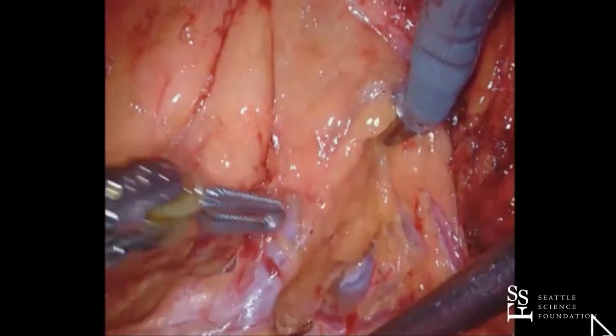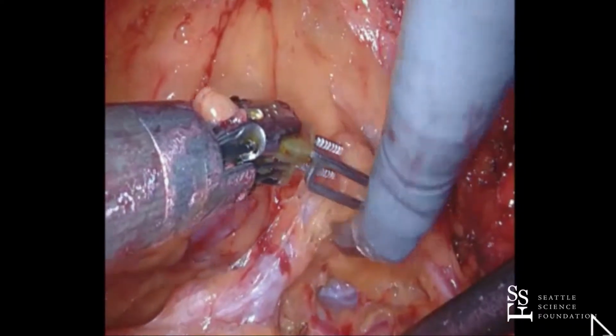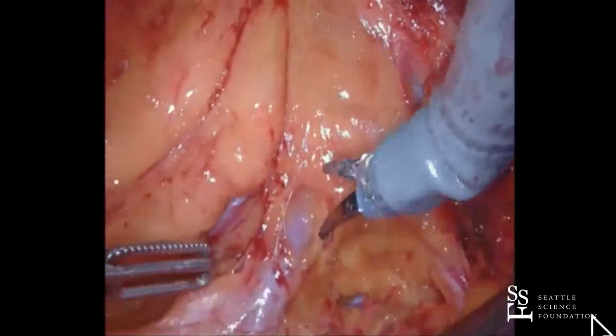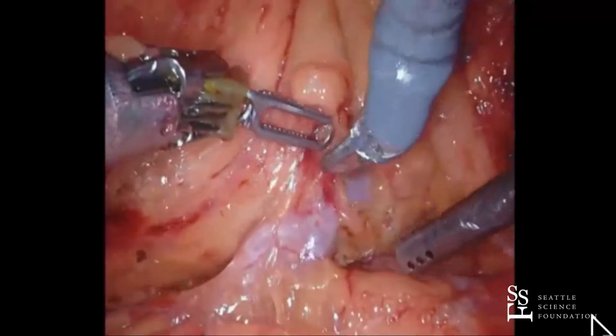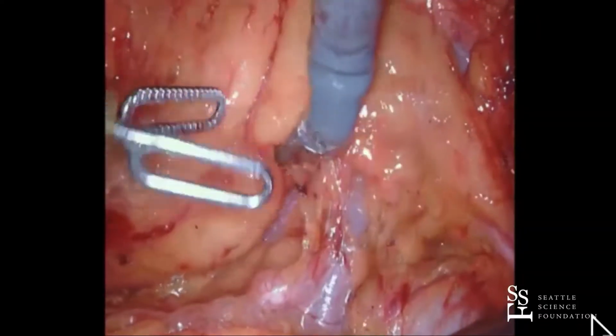So Jim is nicely illustrating one of the major benefits of the retro approach, and that is that your artery is closer to you than the vein. So obviously when you're transperitoneal, you see the vein first and the artery is deeper. In this case, it's the opposite, so the artery is actually easier to get to.